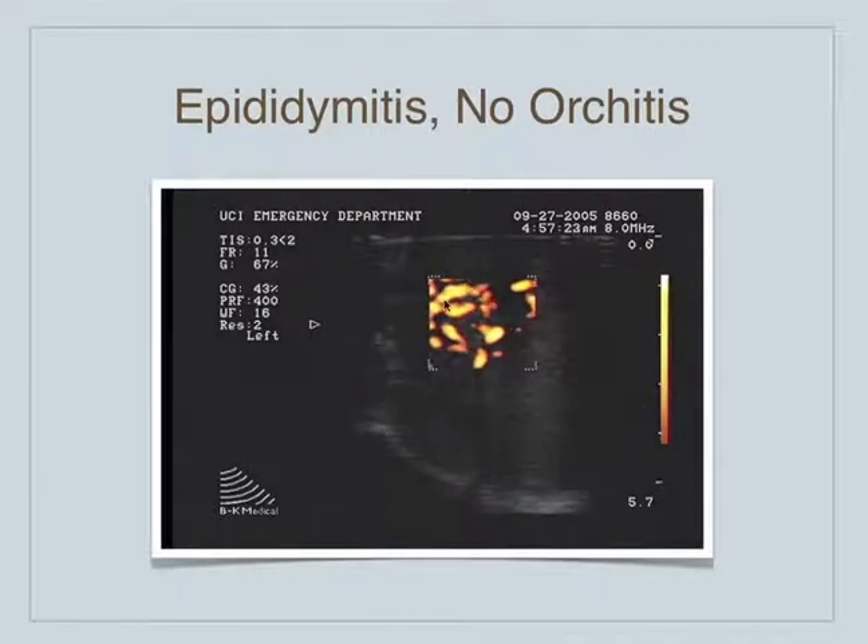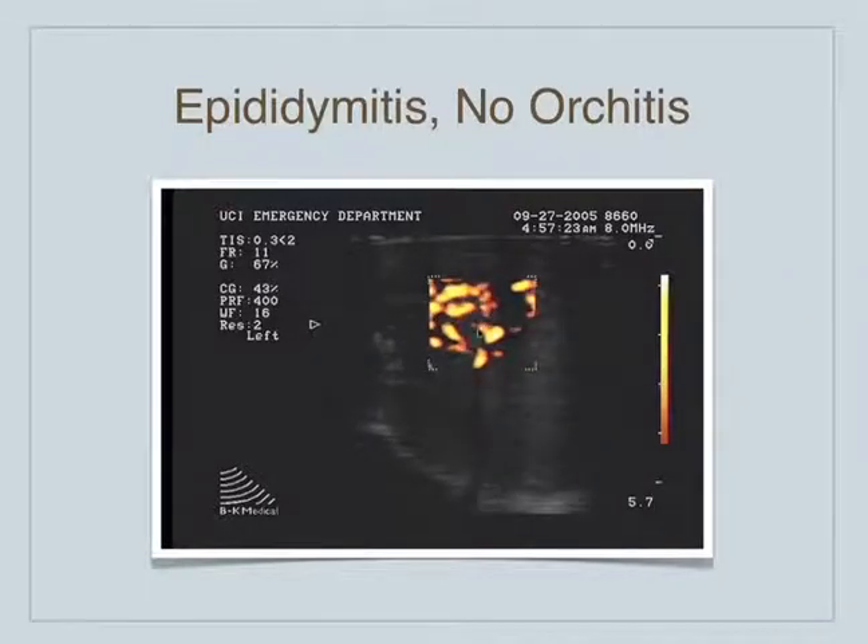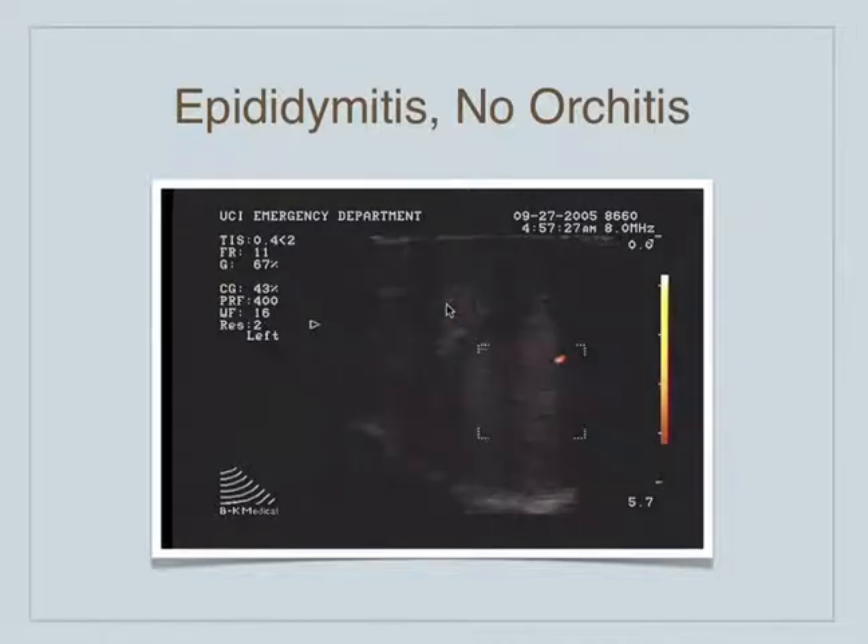This patient just has epididymitis. It's a little hard to see. This is the testicle over here — we move the flow box over here and see kind of a normal flow pattern. But over here we see very hyperemic flow to the epididymis. So this is epididymitis without orchitis, and again, that's usually how it starts.